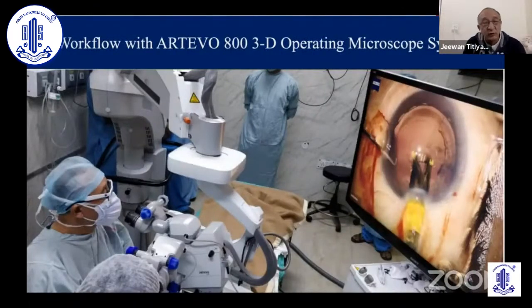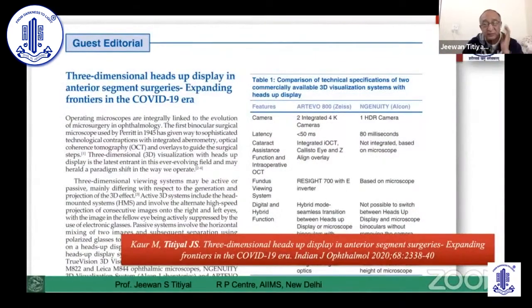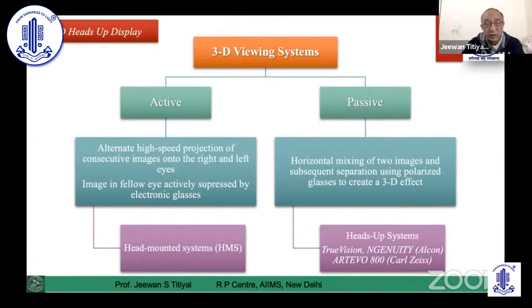What about workflow with the Artevo 800 3D operating microscope? We heard Dr. Garewal taking us through the entire system. This is also a significant increase in the safety of yourself and the patient, and in getting good results. This is our editorial we published in IJO, looking into its advantage in the current normal of working in COVID time.